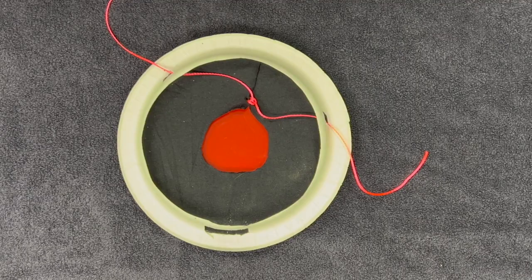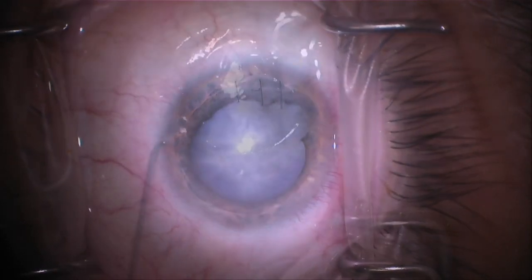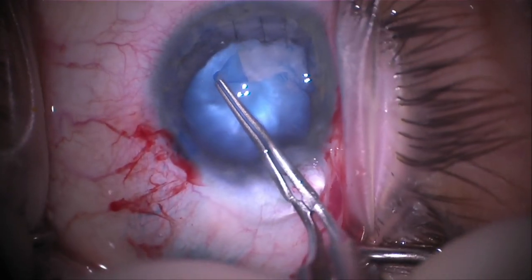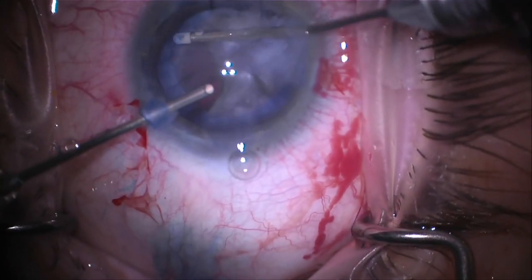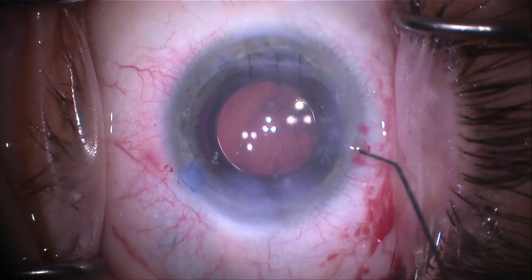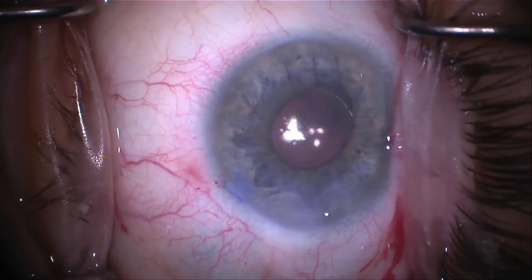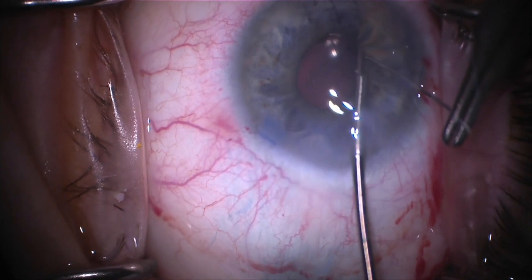Hopefully you can apply this to your own patients. Now that the paper plate model is done, let's look at a surgical video. This is a patient with a traumatic cataract — we'll be taking that out pretty quickly. You can see right over the corneal sutures there's an iris defect. Once we get this cataract out and the lens implant in, it's going to be time to fix this iris defect using a condon-modified sliding knot. Cataract is done. We're giving some Miochol, and you can see that little irregularity in the pupil — it does allow the edge of the implant to shine through.